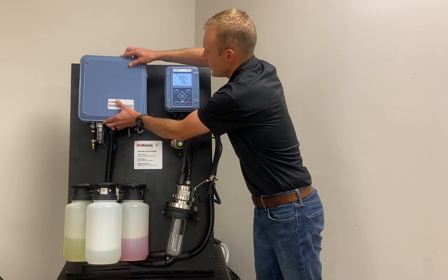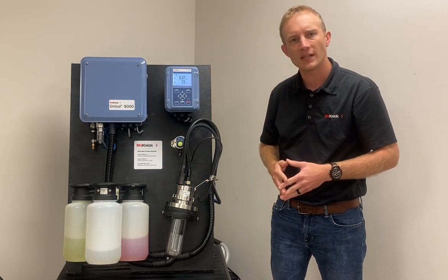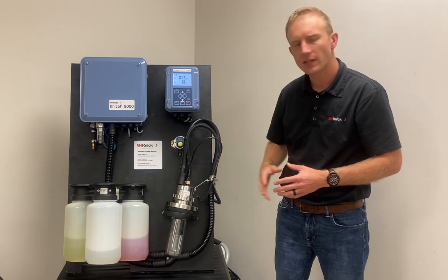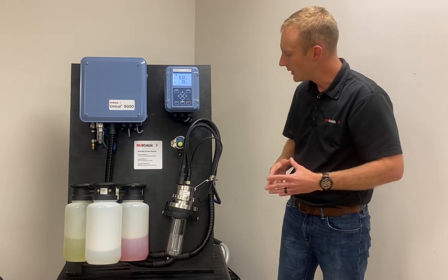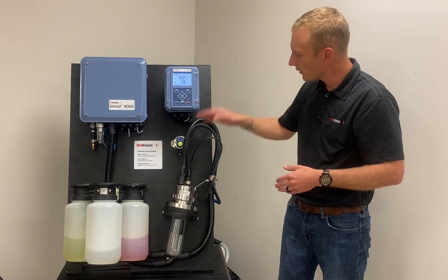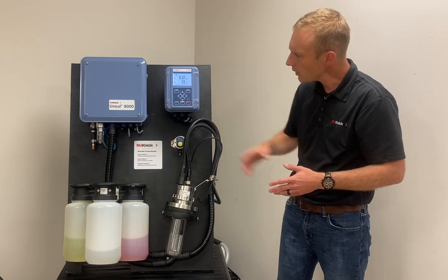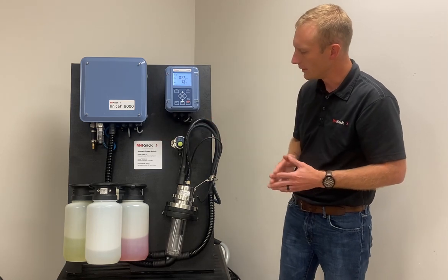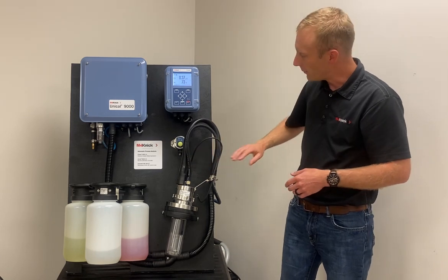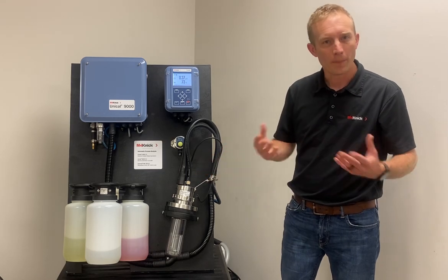We're utilizing the Ceramat retractable holder here. The system can also be utilized with the Sensogate retractable holder, but what's nice is this particular version has a special adapter or connection point to bring those fluids directly into the retractable holder, which is what we have here on the end of our media adapter. Then we have a drain hose going back to a drain behind the demo board, and lastly, of course, we have our pH sensor.